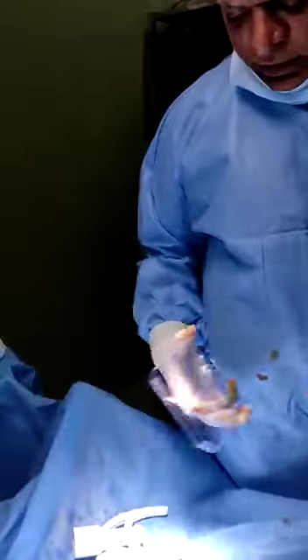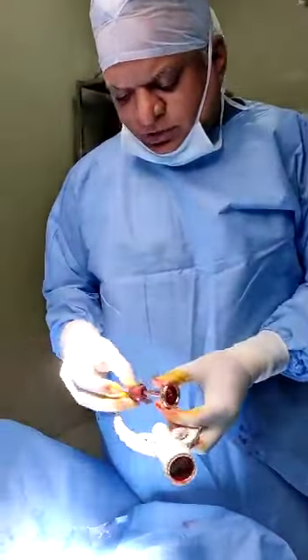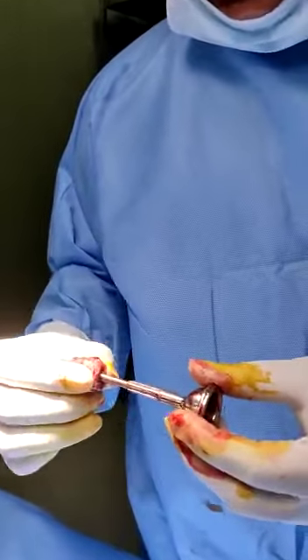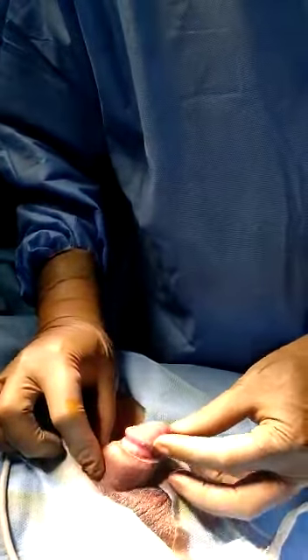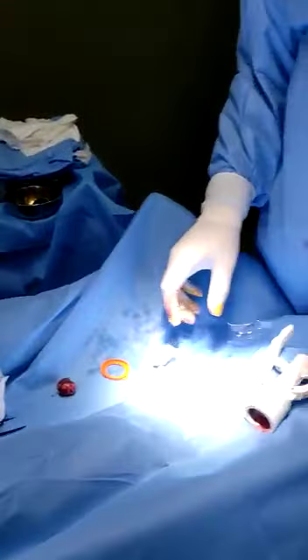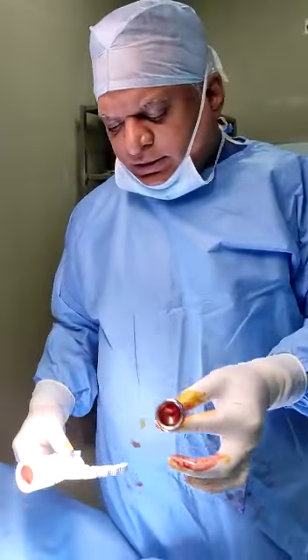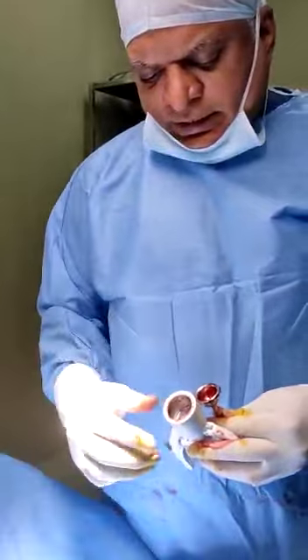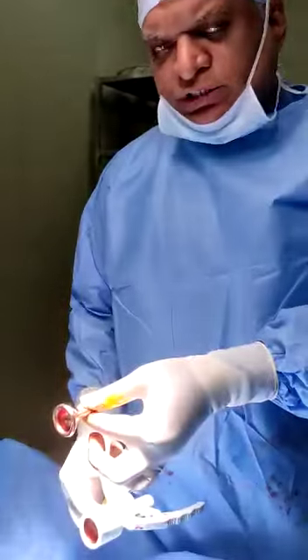This device has two components. This one is already used — the excess skin ring is removed nicely, as I'm just showing here. You can see how it looks beautifully, without any bleeding. There is a little local edema because I have used local anesthesia; that will settle down in a day. This is the inner part and this is the outer part, and this goes inside to protect the glans.